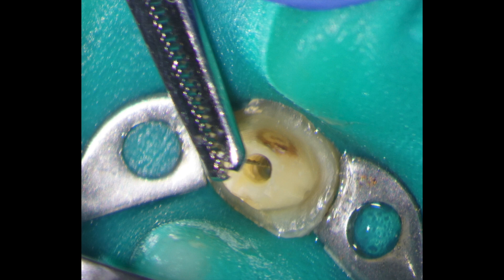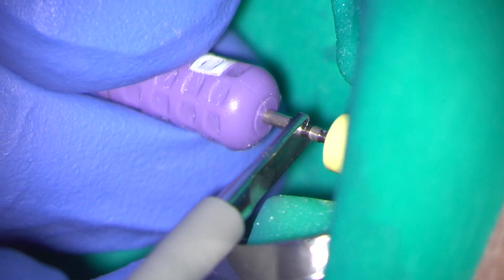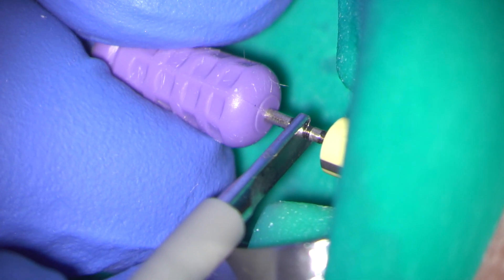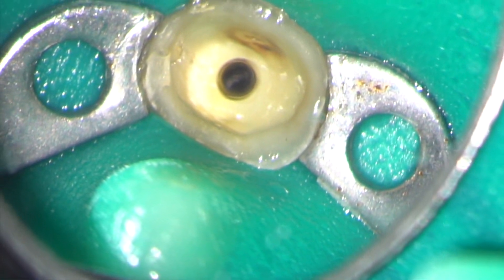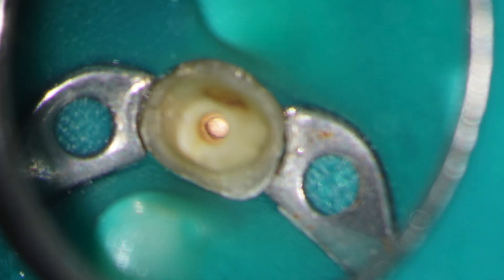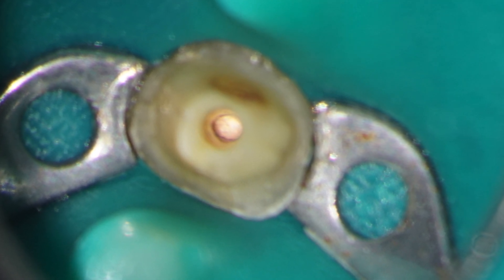The entire piece of file could then be retrieved with forceps. I now continue with root canal preparation, disinfection and obturation using a single file technique. Here I'm using an electronic apex locator to confirm the working length, a single file — in this case an edge endo small — to prepare the root canal, and then obturation with a vertically compacted gutta percha technique. The access cavity was filled with a dual cure composite.